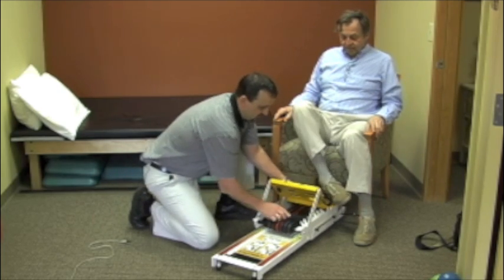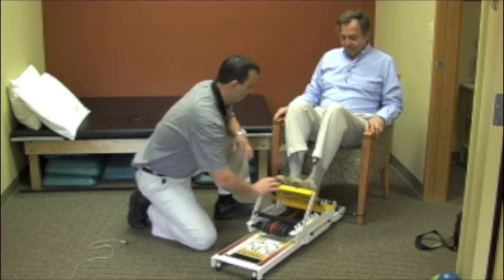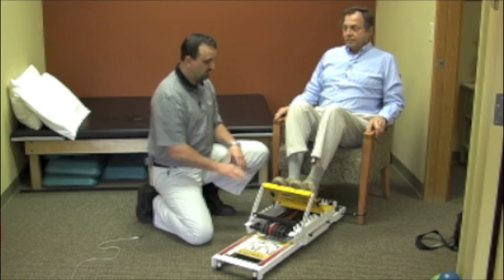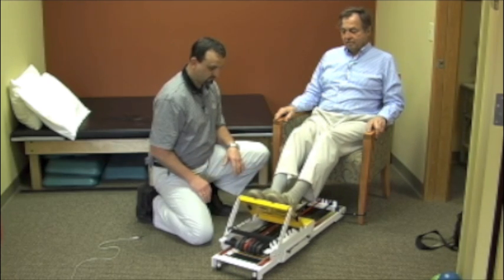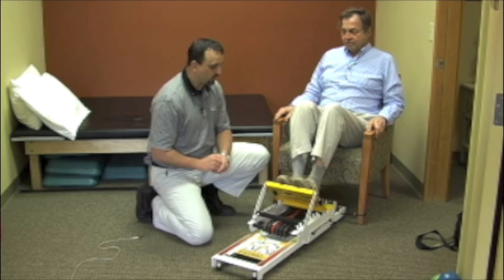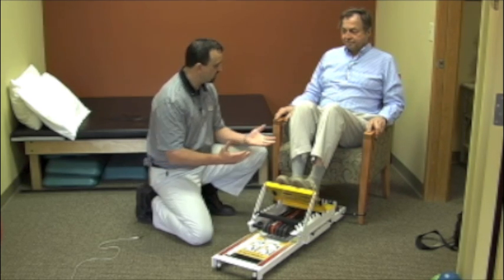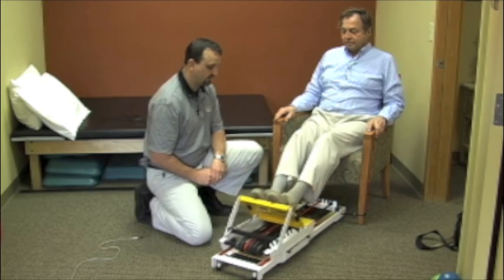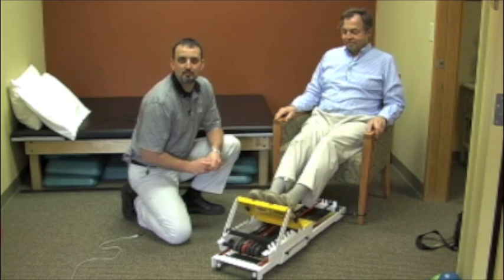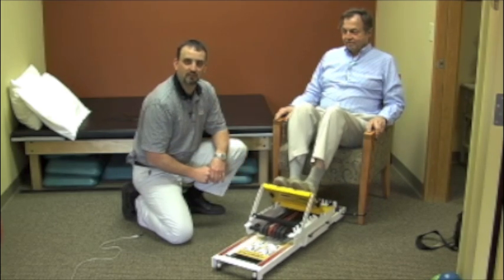I'm going to bring this up a little bit. Have you put both feet on the Mini Press foot plate, or the push plate. With them sitting in a nice position, gently push that out and control back. We're going to get concentric work and eccentric work of the lower extremities with pushing. Let's give you about five or six nice easy pushes.